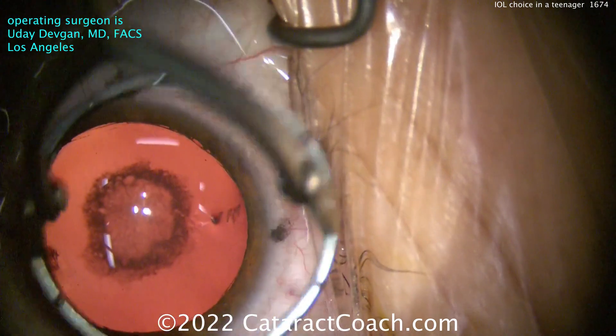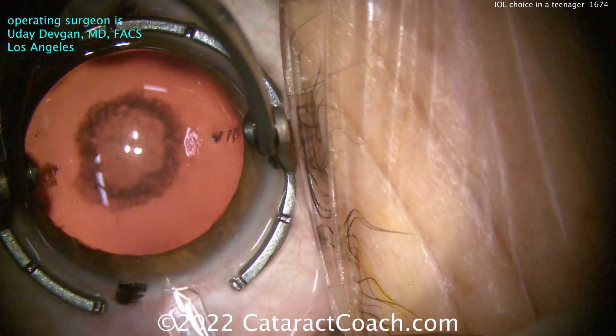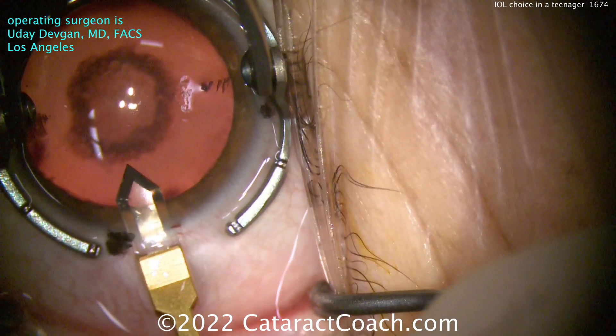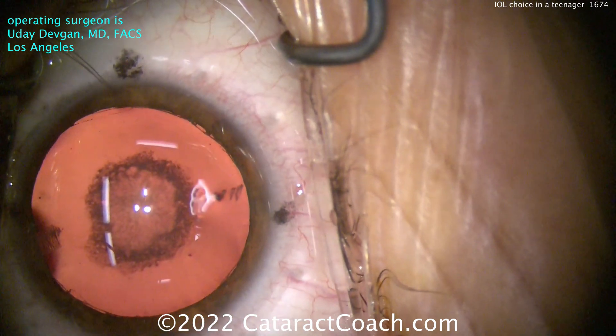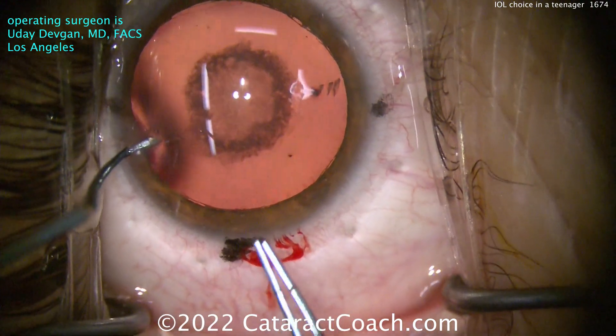There are a couple of eyelashes on the top left of your screen — I see them. We had a hard time putting drapes on this patient because the patient was very nervous. There's the incision — we're making that incision now. That's a tiny diamond blade. We're going to expand the incision to about 2.2 millimeters wide. The patient has the same kind of cataract in both eyes, so the patient is definitely going to need both eyes done.